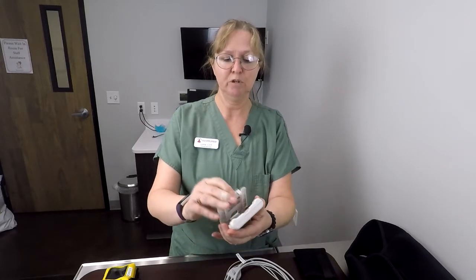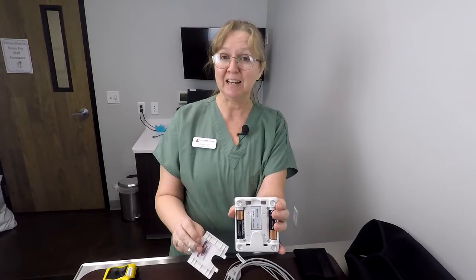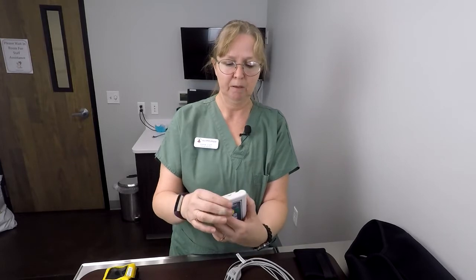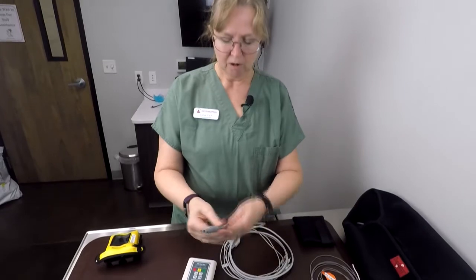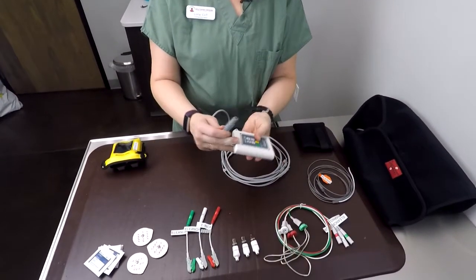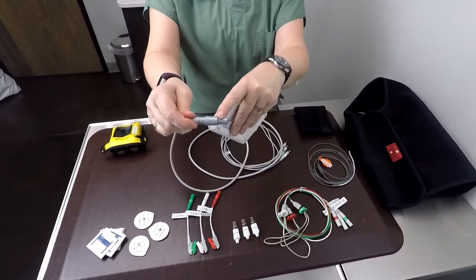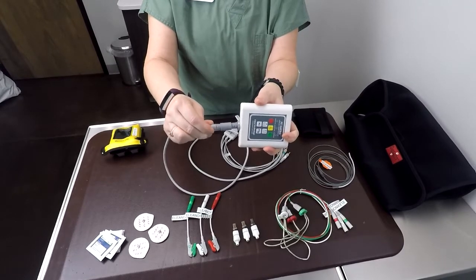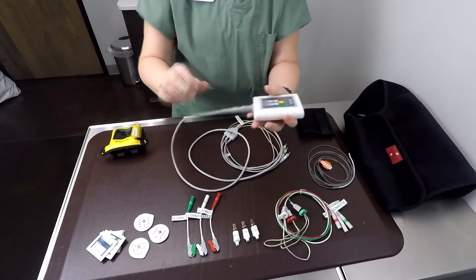With these units, remember that they run on batteries. So if you start to use a unit and it doesn't work, the first thing you should do is change those batteries. The other thing in the kit is the primary connector cable. Unlike our old units that had wires or little pins that had to be lined up, these have an extra little attachment so it lines up really easily with the outlet and just snaps right in.